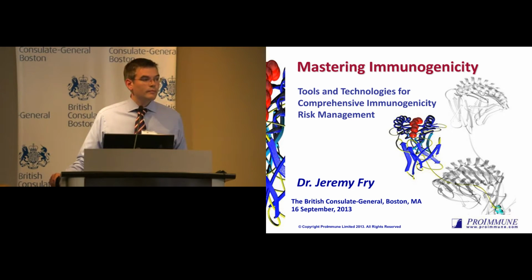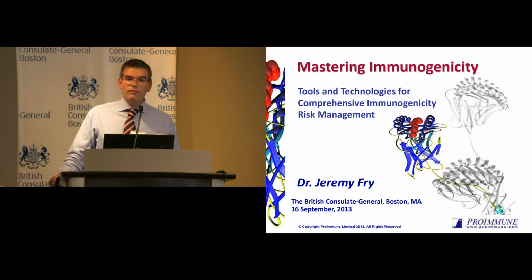Roche have worked on this type of assay, and they've used a CD28 super agonist, and they do consistently get positive results. You could buy research grade CD28 antibodies, and you would probably find that you get a 100% positive result in this type of assay. But it's not a clinically formulated drug, so we don't use it as an assay control. And Campath is a very good positivity assay. It comes out positive every time we do it.